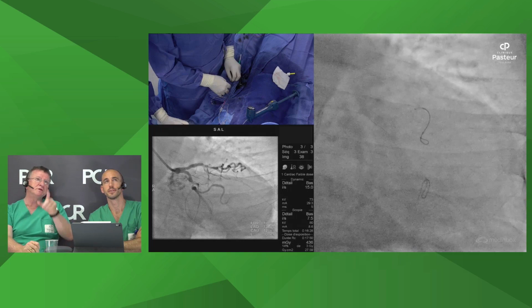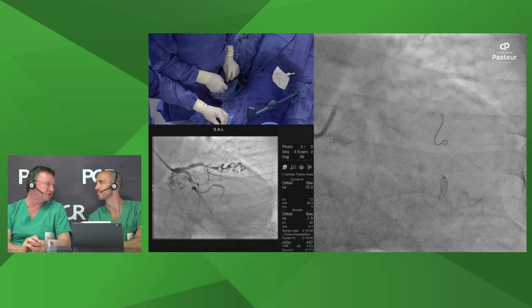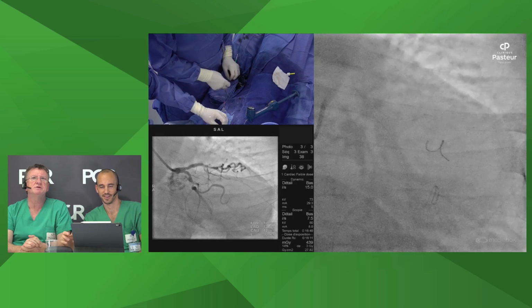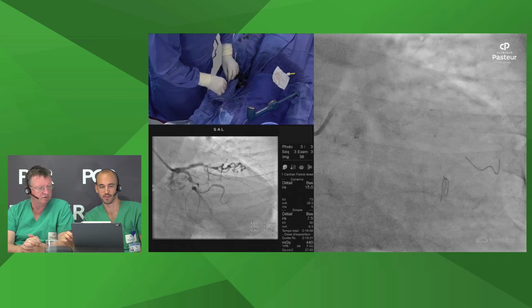But this patient, the main trunk... I'm not sure an Amplatz would offer a lot here because the left main stem is not one of those particularly short ones. It's not too bad, so I guess my next option here would be to go to the guideliner at this point in time. Yeah. Maybe more distal. Okay, now in the audience, stop. We have a lot of guideliner propositions.